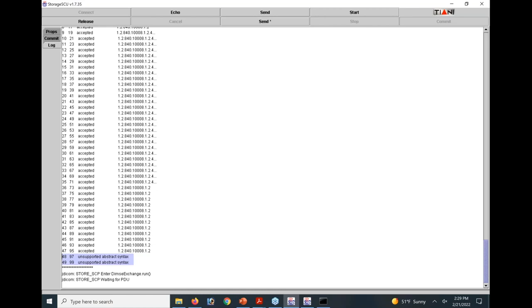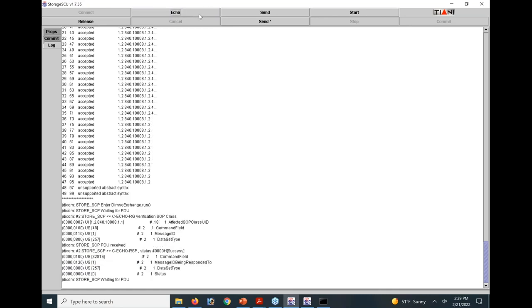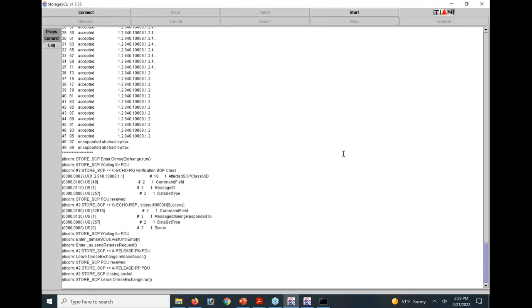What PDU is this right here? PDU 2. The SCP coming back and saying, yes, I will accept that. I haven't even sent anything yet, right? So here's an echo. Echo request, echo response. PDU 4 and 4. I hit release. Right, and there's your 5 and 6, right?